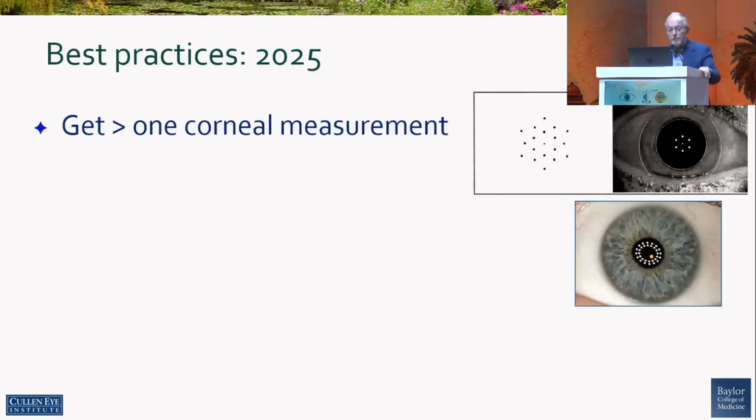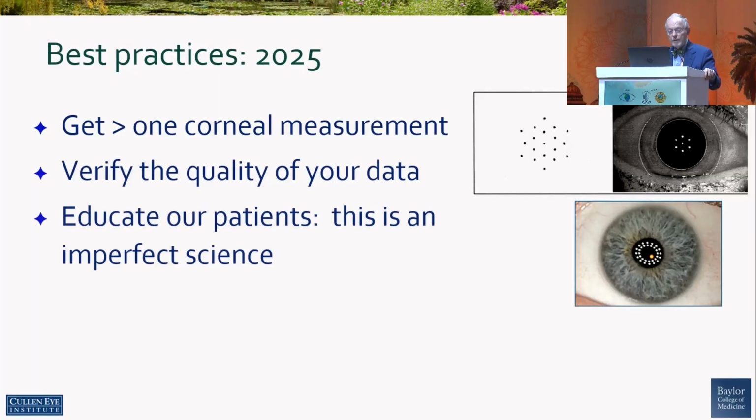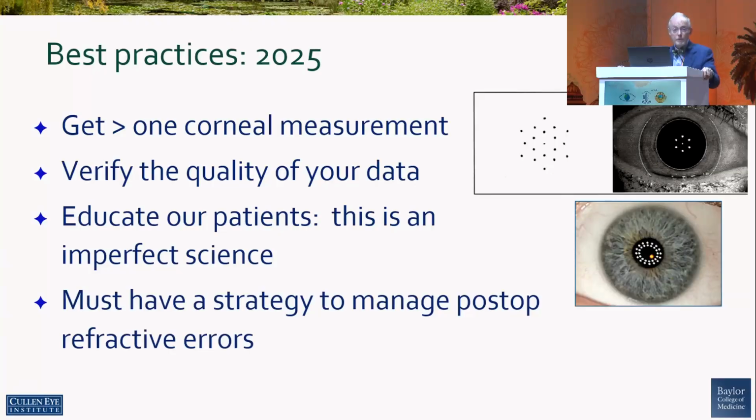Best practices this year: get more than one corneal measurement, preferably two or three. Verify the quality of your data, and we have to educate our patients that this is an imperfect science. And of course, have a strategy to manage postoperative refractive errors, particularly with our multifocal patients.